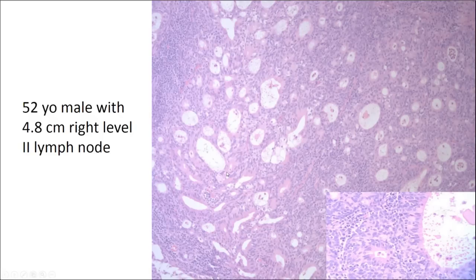But as we looked into it further, we actually recommended doing a P16 stain, and the patient wound up having a primary in the right base of tongue. So this was a very bland-looking oropharyngeal cancer. So just always keep in mind that sometimes these HPV-related tumors can be very bland.